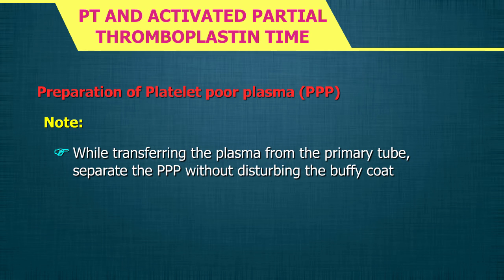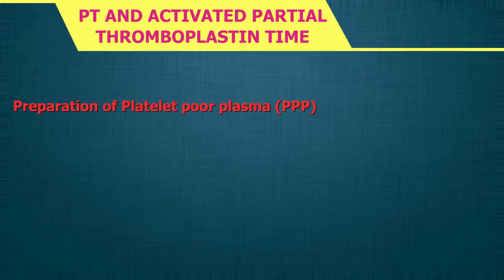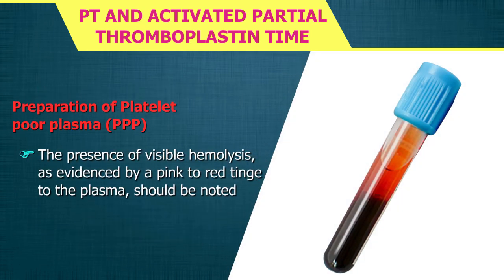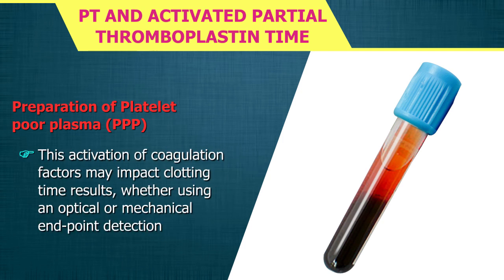When transferring plasma from the primary tube, separate the PPP without disturbing the buffy coat. When aliquoting to a secondary tube, take care not to include residual platelets that may have collected at the bottom of the centrifuge tube. Note the presence of visible hemolysis indicated by a pink-to-red tinge. Lysis of red blood cells and release of intracellular or membrane components may cause clotting factor activation, impacting clotting time results whether using optical or mechanical endpoint detection.